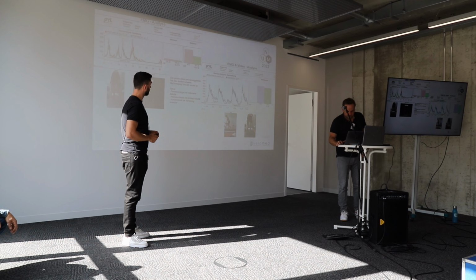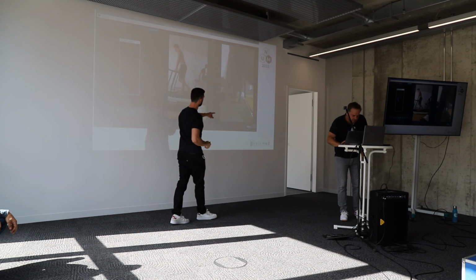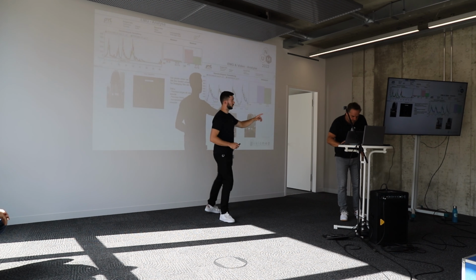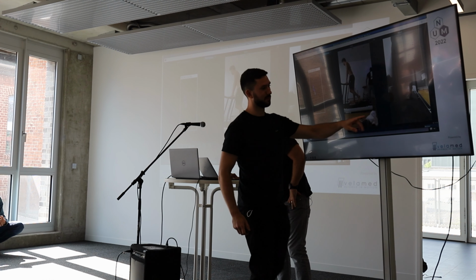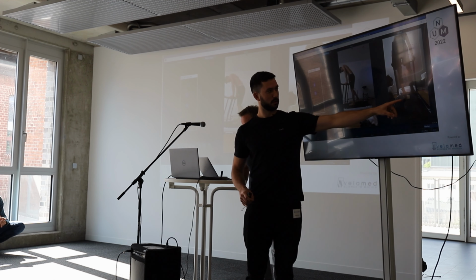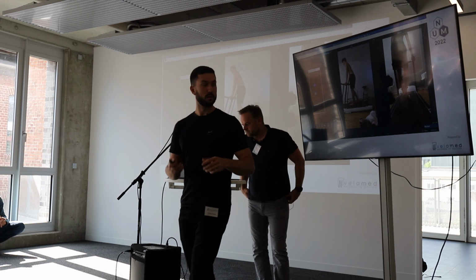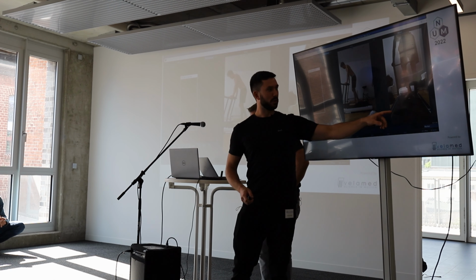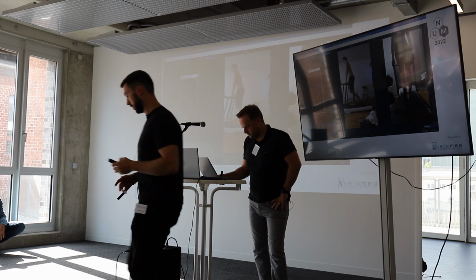So just play it again, the video, so that you can see it. Or on this screen, perhaps it's easier to see when I'm away from the camera again. You see how slowly and insecurely he's moving the ankle joint, and how uncomfortable he feels when getting in this position, and how easy it is for the other part, and how fast he can move out of the position and straighten the joint.